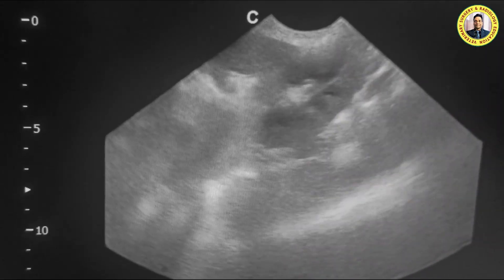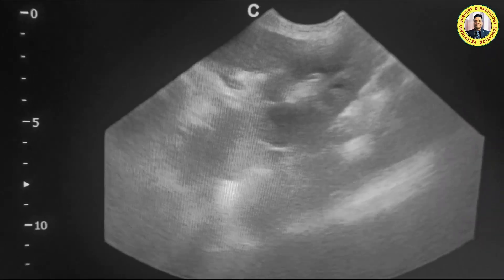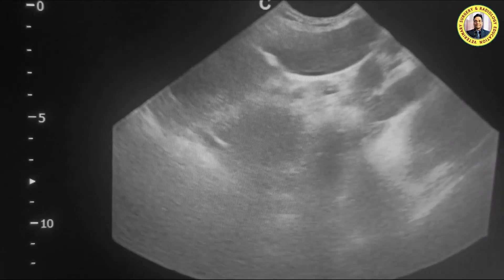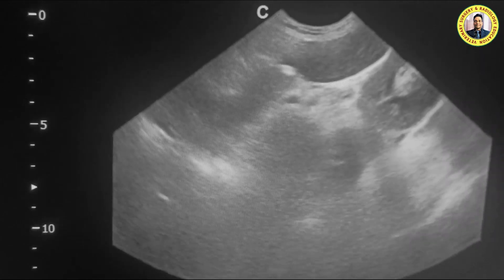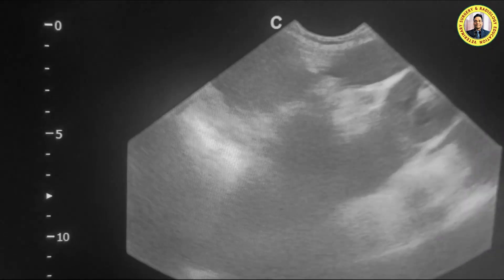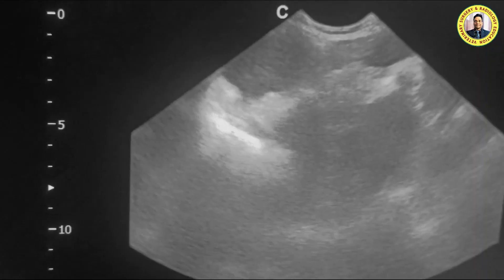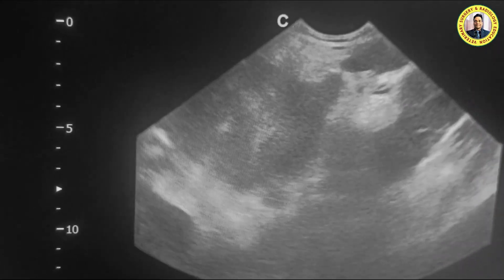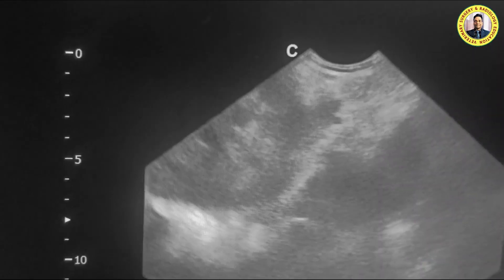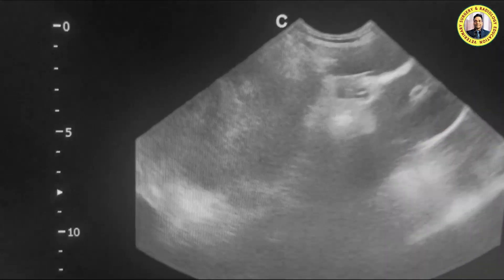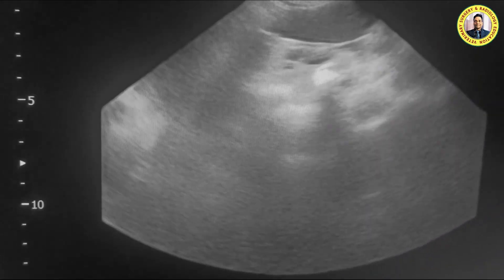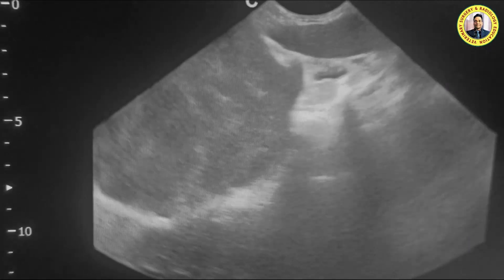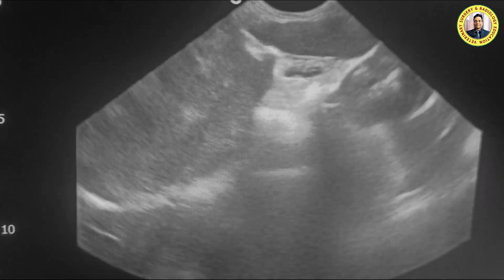The corticomedullary differentiation is normal. Here you can see the spleen, and now we are going towards the head of the spleen. You can see this mass appears to be arising from the spleen — there is strong evidence that this tumor is a splenic tumor.